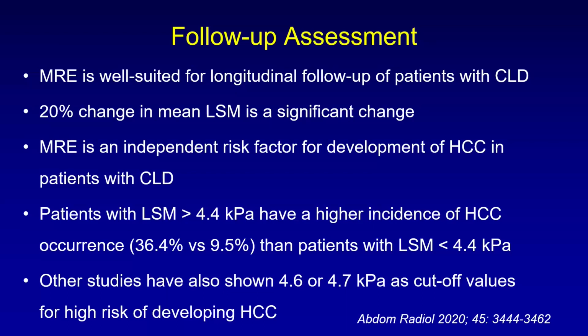So, follow-up assessment: MRE is well suited for longitudinal follow-up of patients with CLD. And typically for MRE, if you are acquiring it on the same machine with the same vendor, you have the delta changes, which are very important. So the change in the LSM on MRE, you can actually look at it, and a 20% change in mean LSM is a significant change.